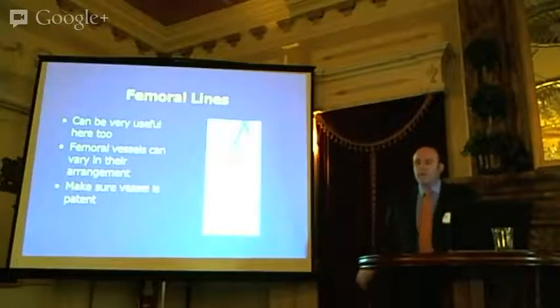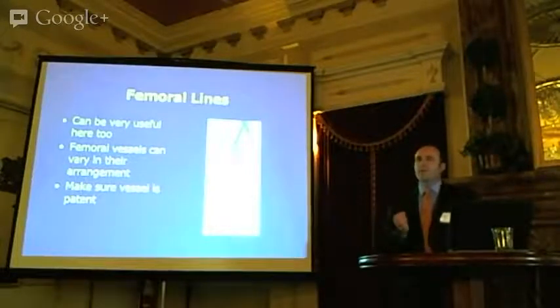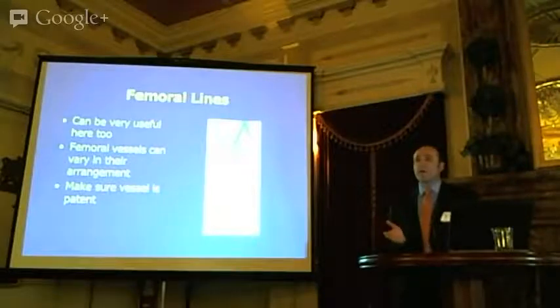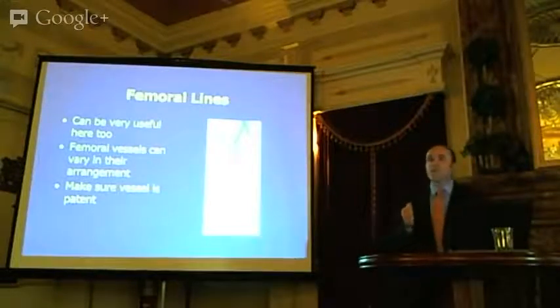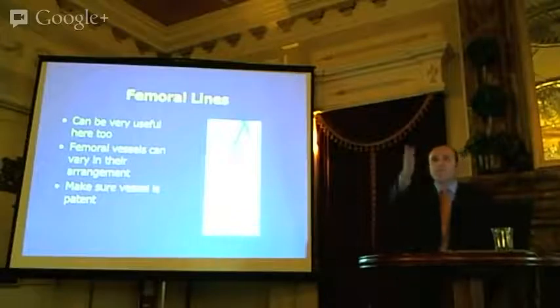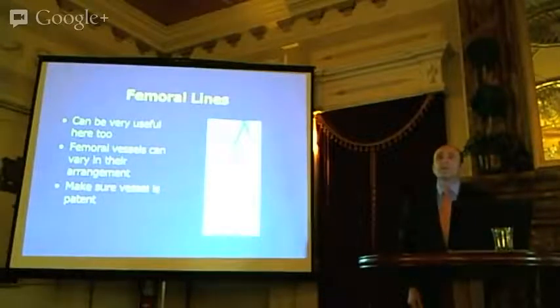The caveat is that I did this in a code, and that's why I went into the femoral artery. I used to believe that if in a code the patient's dead, you stick the femoral artery, and even if they have a bad outcome, you can just say that. There's a case from Hackensack, New Jersey, where the guys worked really hard, put in a femoral catheter that ended up going into the femoral artery. The patient ended up losing a leg, $5 million. There's no reason to put in a femoral line blind when you have the ability to do an IO.